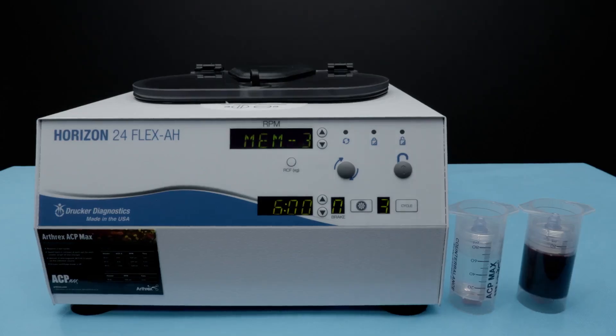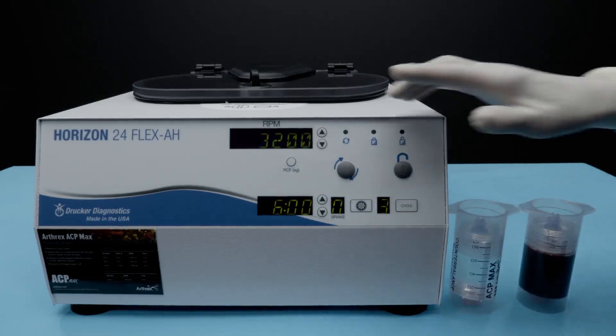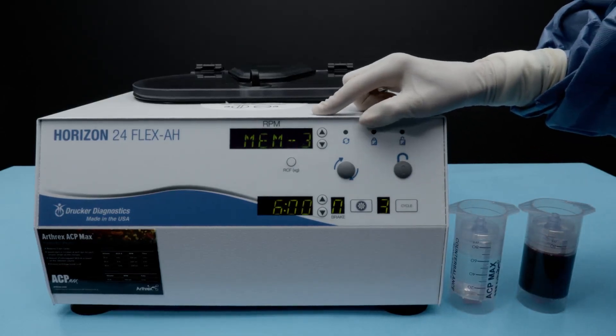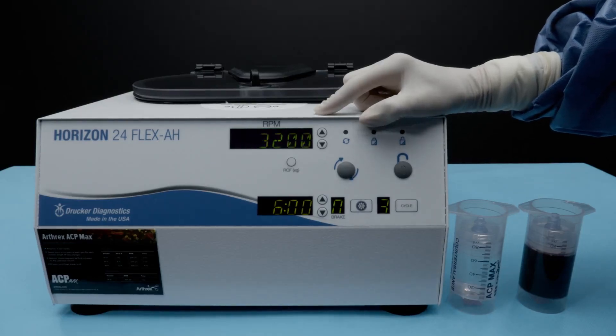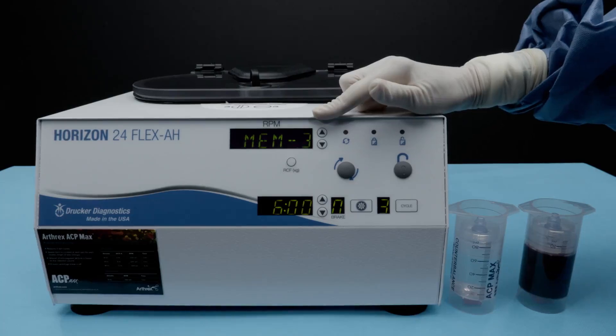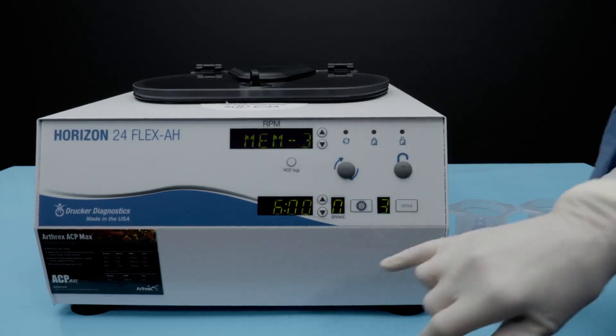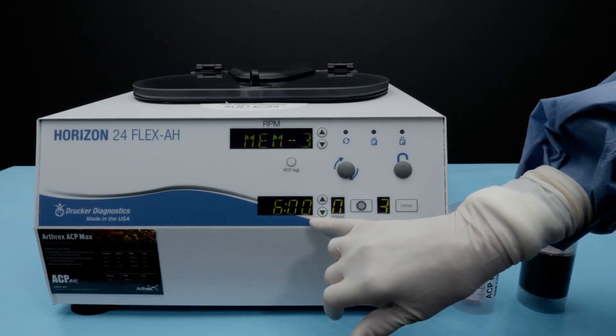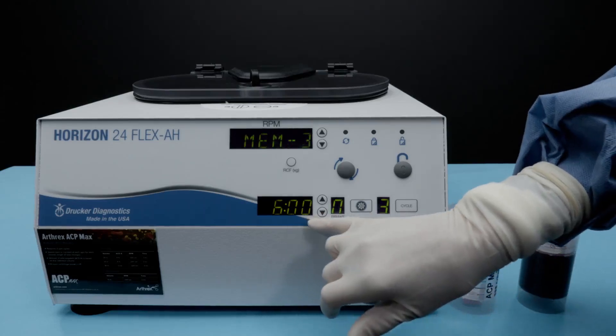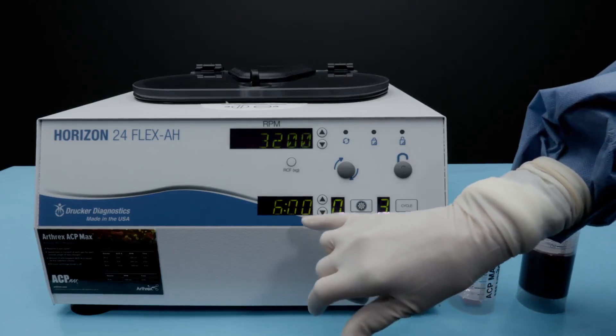The ACP Max device can process 30, 60, or 90 milliliters of peripheral blood. It will require you to change the time setting, but not the RPM setting on the centrifuge. The RPM setting for the first spin will always remain at 3,200 RPM. The time will change. If you're processing 30 cc's, you'll do a 3-minute spin, 60 a 6-minute spin, 90 a 9-minute spin.